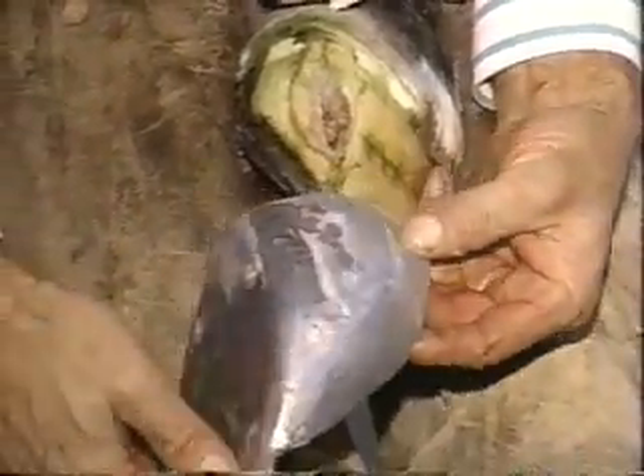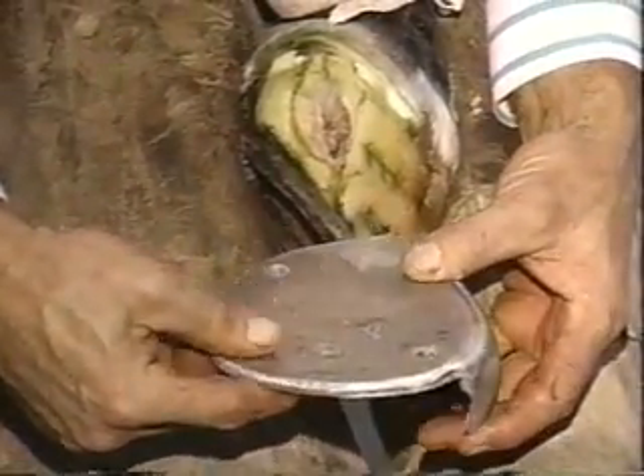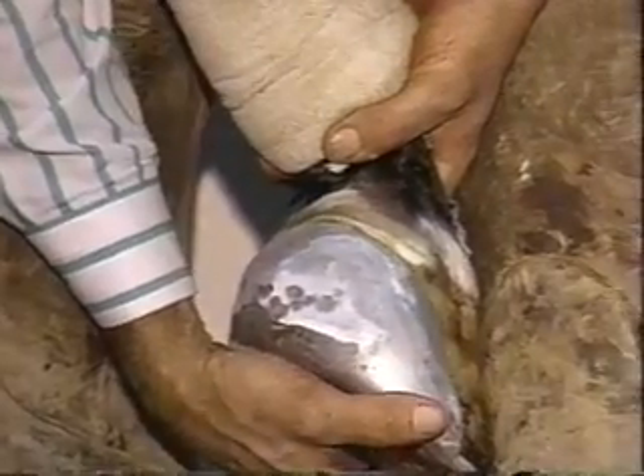You develop a shoe that has a wing such as this. This is made out of one quarter inch aluminum, and has been forged out to basically meet the shape of this particular foot. Of course, this all needs to be done prior to surgery.